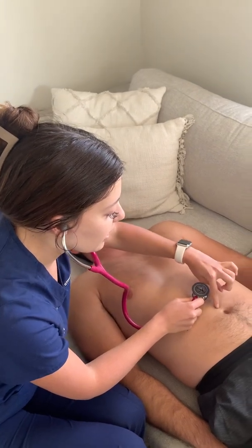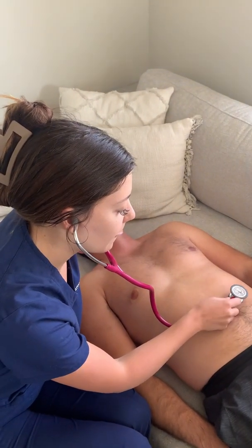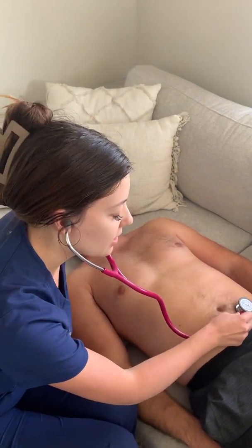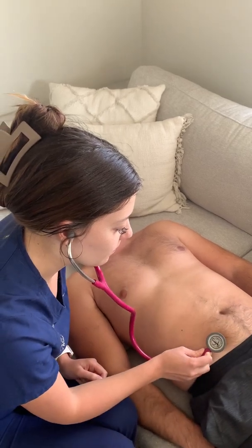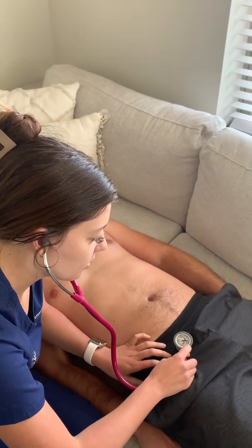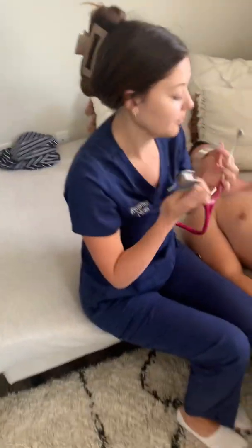And then right above his umbilicus, about 2 centimeters to either side will be his renal arteries. I'll listen for bruits there. And the other side. And then below the umbilicus, 2 centimeters on either side, we'll listen for the iliac arteries. And then we'll listen at his femoral arteries. And I did not hear any bruits.